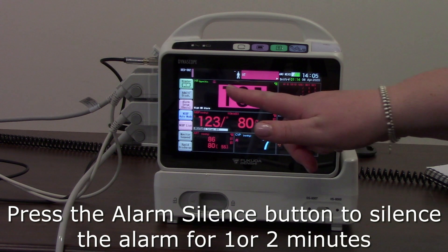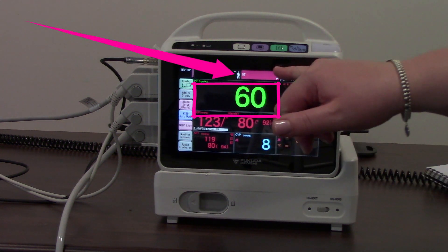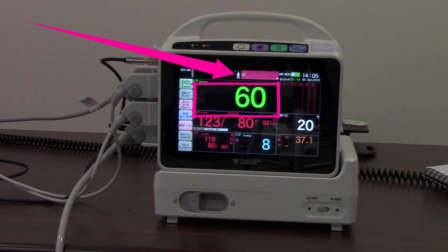You'll also notice that the parameter itself highlights, and you also get an alarm message at the very top of the monitor as well.